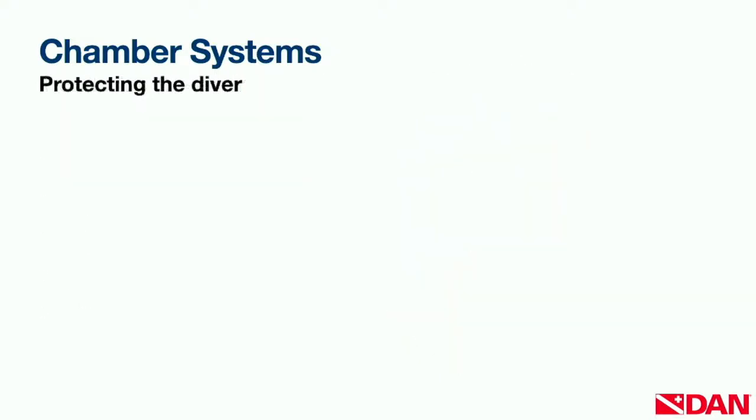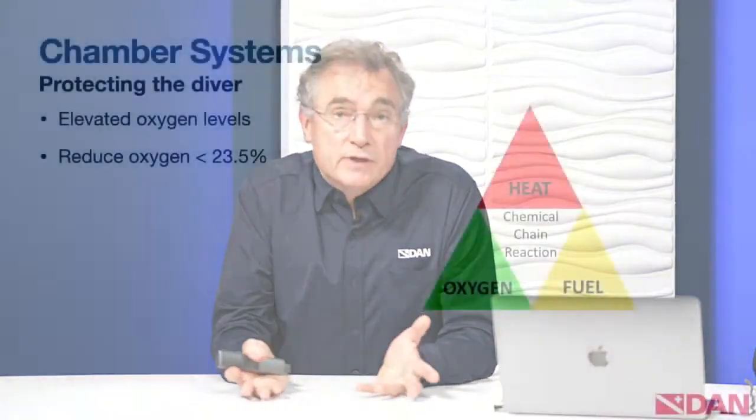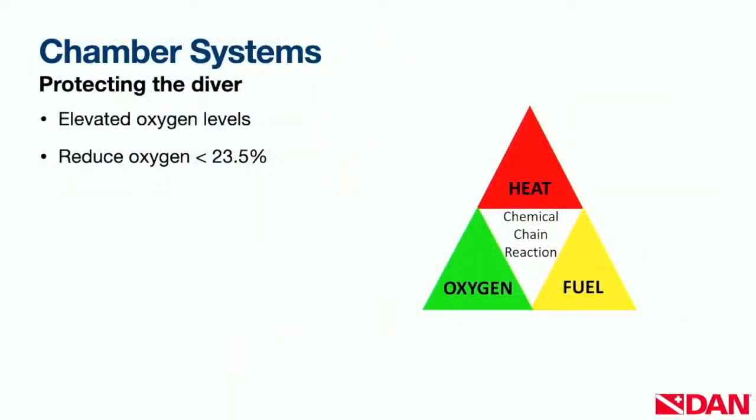Then lastly, we need to protect the diver and obviously the tender and everybody else around the chamber. So our primary concern during a treatment is going to be these elevated levels of oxygen. That's something the operator on the outside will be continuously focusing on, reading the oxygen levels and making sure it never gets above this magic level of 23.5%. This evening, we won't talk about where those levels come from, but what we can tell you is that under pressure, anything above 23.5% oxygen, the flame speed and heat of ignition become very, very difficult to control. So if we're going to have a fire, we want to keep the O2 level as low as possible. But clearly, we don't want to get rid of the oxygen because people don't survive very well with no oxygen.